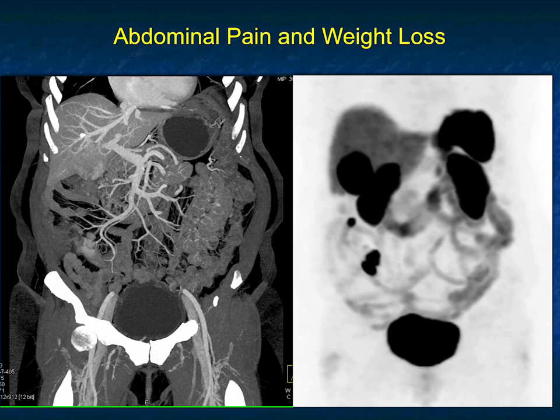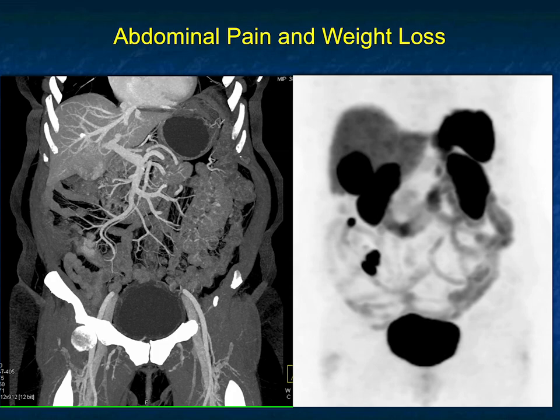It's not an adenocarcinoma — that's not the appearance. It's not going to be a GIST tumor — that's also typically not going to be the appearance. The classic thing you're going to get an octreotide scan on is a neuroendocrine tumor. So what do we have here? We have a carcinoid tumor, multiple sites, as well as liver metastasis. What a great case.